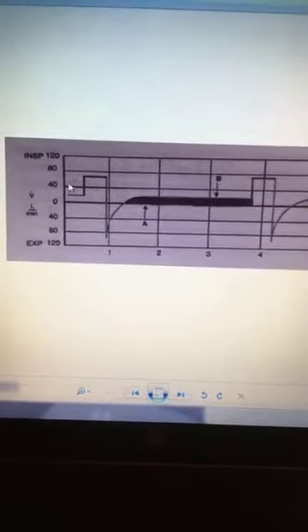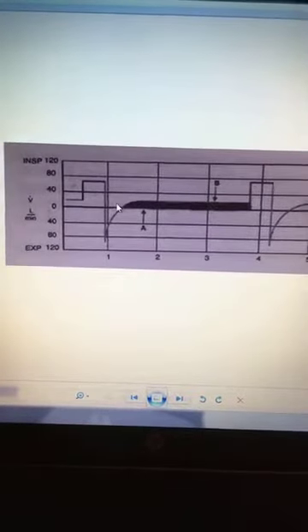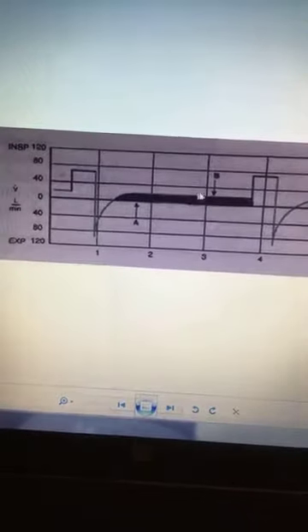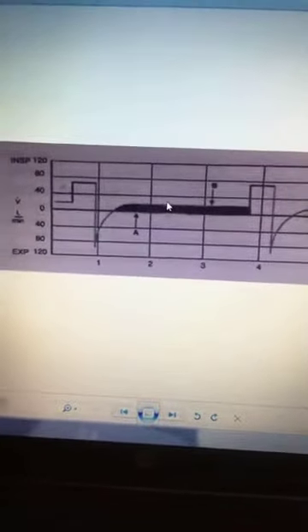You can see the patient's inhalation and exhalation. Again, this is the flow, and the flow continues even though the breath is done. This highlighted continuation is the visual representation of the leak. That flow is continuing to go even though the breath is done. Obviously, you want to go through your regular troubleshooting techniques to make sure there are no unwanted leaks anywhere in the ventilator circuit.